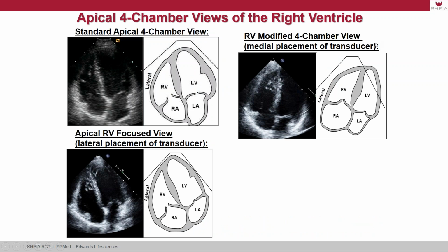Because we have seen, in particular in some previous study and in partner 3, that TAVR appears to better preserve the RV function compared to SAVR. So that will be an important echo endpoint here.